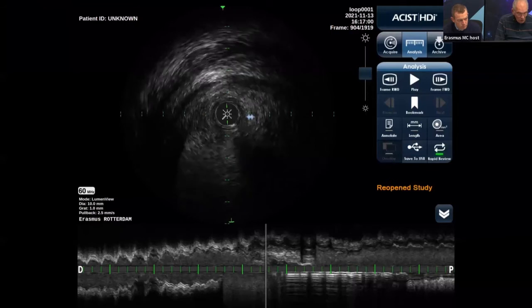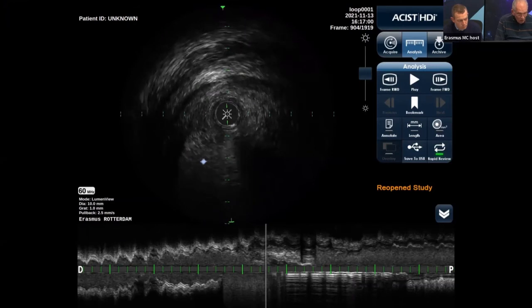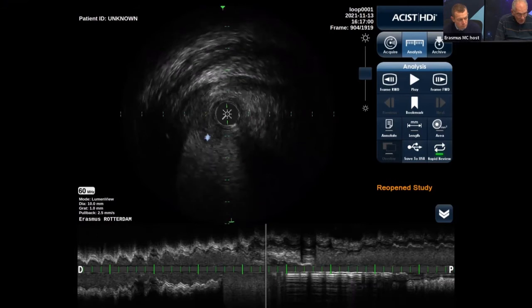So there is thrombus in here, and definitely you can appreciate that if you compare it with the moving blood in here. You can appreciate thrombus also on this spot, and definitely there will also be thrombus more deeply in this bag, which we appreciate on the angiogram. So where's this thrombus coming from?